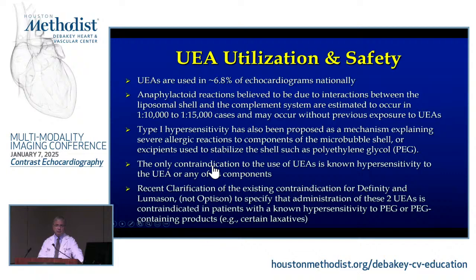This is in relation to a few cases with anaphylactoid-like reaction that you probably heard about, and I'll share some of the data that we know. Contrast agents are used nowadays in almost 7% of all echocardiograms in this country. If I had given this lecture 10 years ago, it was close to 1%. It may still be underutilized depending on where the pockets are. There is rarely overutilization, unless people are mandating contrast in every ICU patient or every stress echo. But utilization really depends on the setting and the images you get, outpatient versus inpatient versus instrumented, etc.